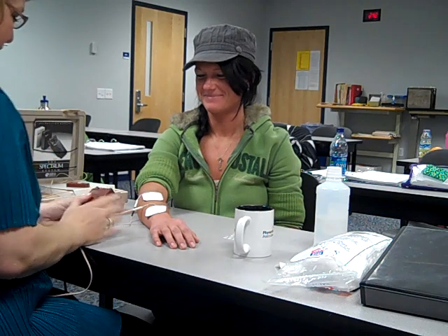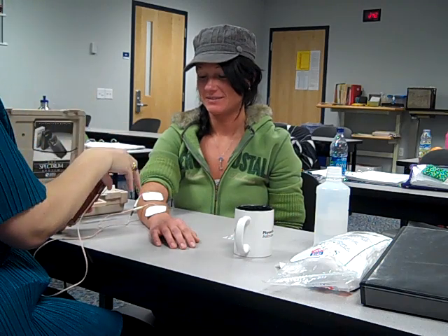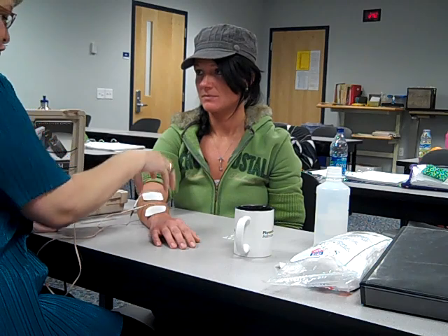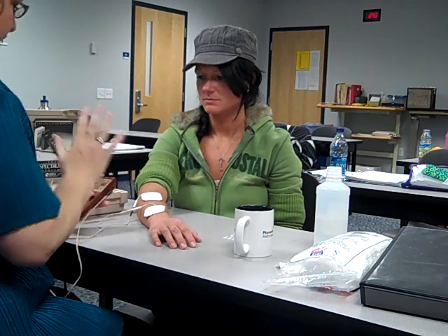Before I do that, I tell my patient what I'm going to do — if you start turning knobs, they get really nervous. What I'm going to do is change the width on here a little bit. What I'm looking for is to make it change the sensation you're feeling. You're going to feel one of two things: either the sensation is spreading out to a bigger area, or it's getting smaller, more under the electrodes. I'm going to go really slow — tell me, does it feel more spread out or deep under the electrode? Spread out. Good, I want to go a little further. Spread out again. Now a little more deep. So if it's deep, what do I need to do? Go back. So I find the most spread-out position, then check — does it feel more comfortable now, more spread out? That's where we're going to leave the width.